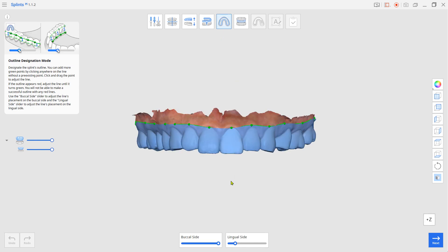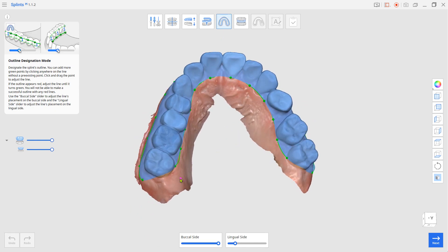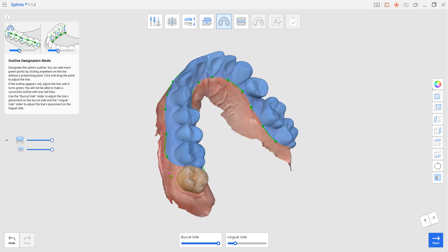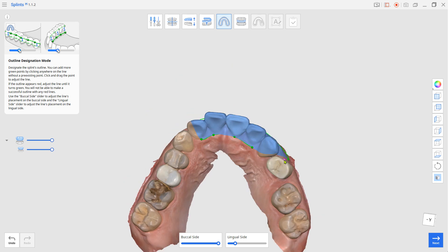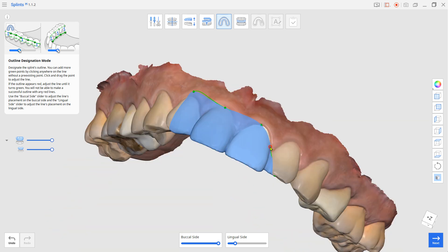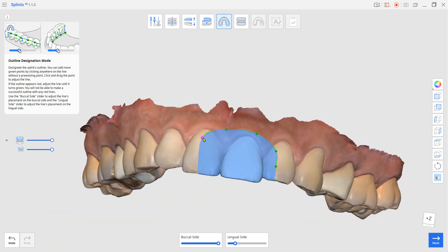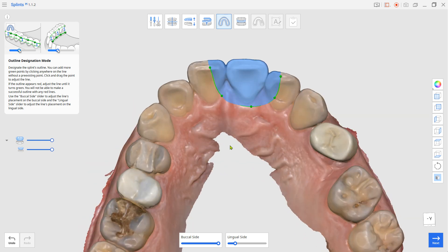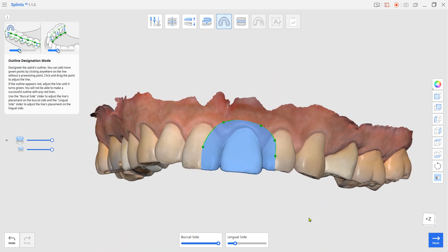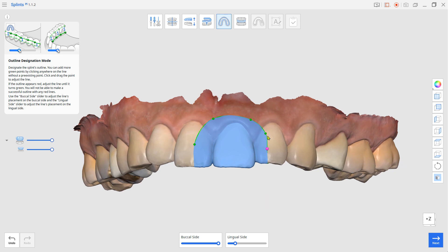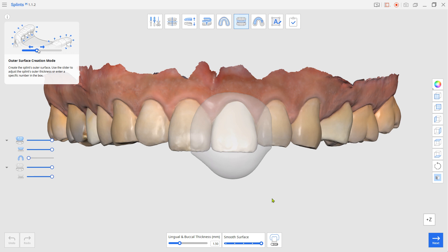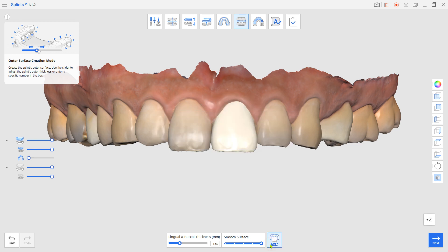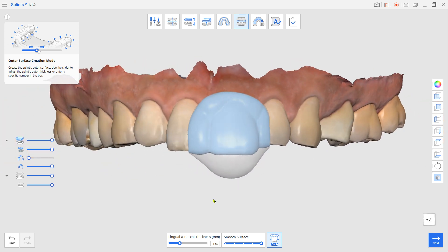Set the margin for only the necessary area. In Outer Surface Creation mode, turn on the dual layer splint from the bottom. Click Complete to save.